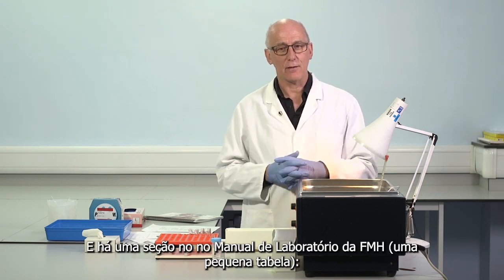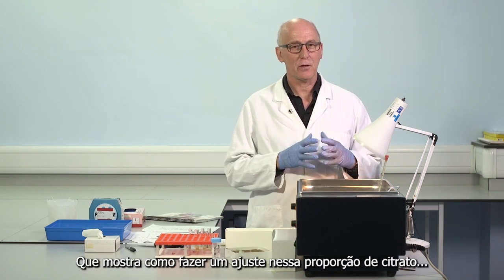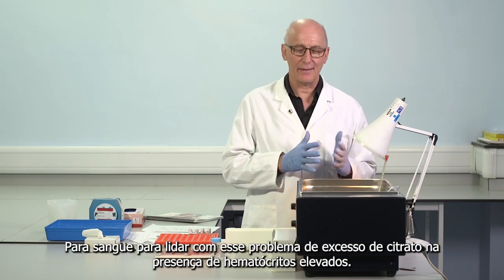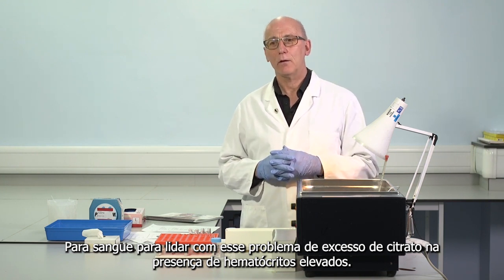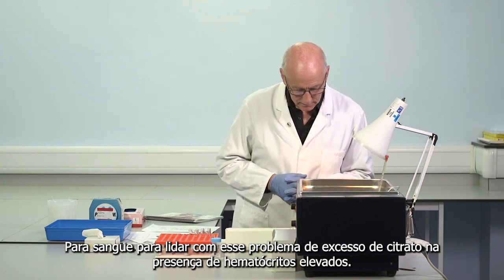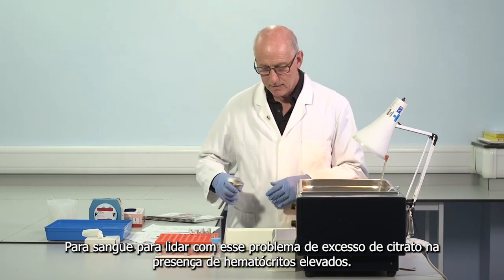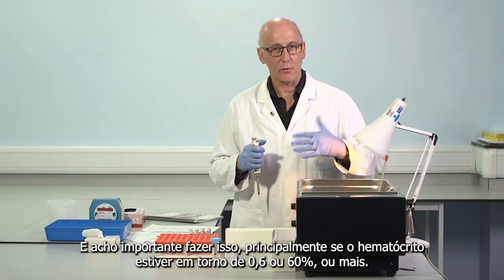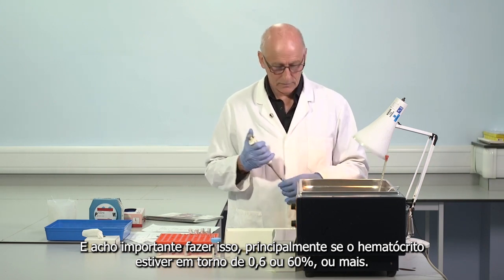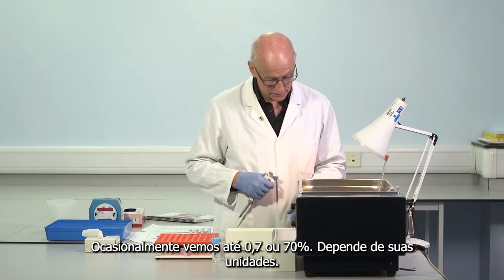And there is a section in the WFH laboratory manual, a small table that shows how to make an adjustment in this citrate to blood ratio in order to deal with this problem of citrate excess in the presence of raised hematocrits. And I think it's important to do that, particularly if the hematocrit is up around 0.6 or 60 or higher. We see occasionally as high as 0.7 or 70%, depending on your units.